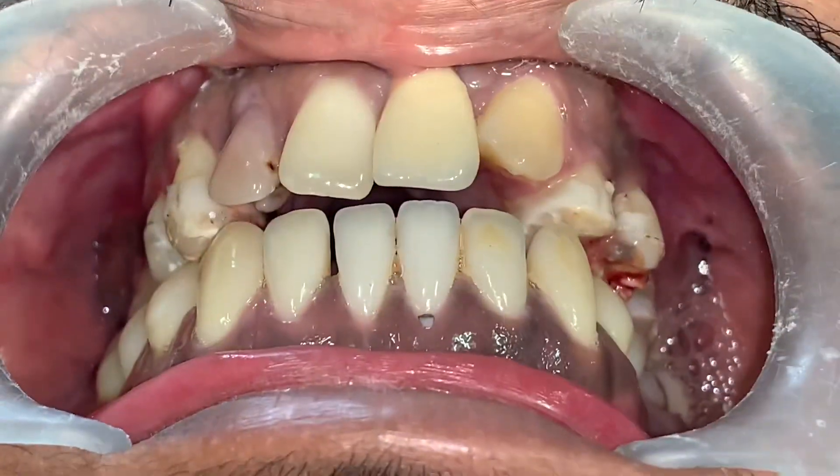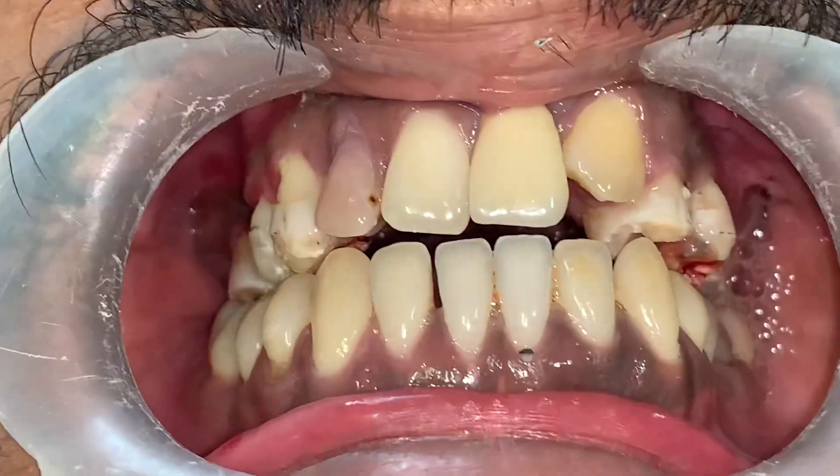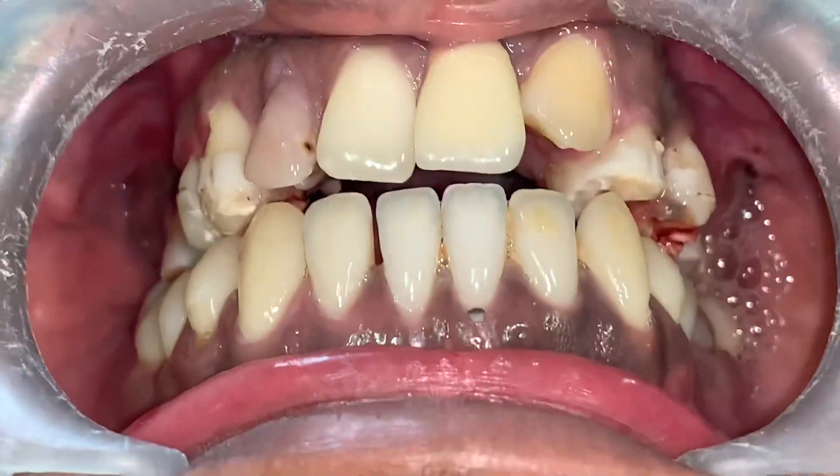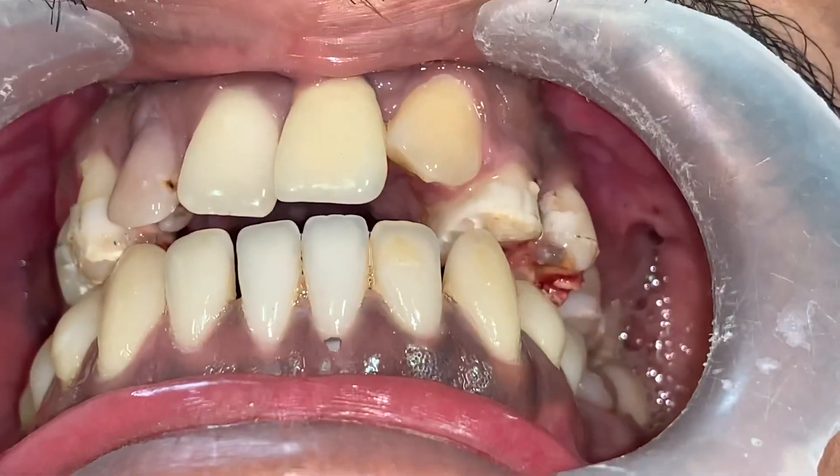You see the occlusion of the cheek — the aperture has moved forward because of the new bone growth, the new bone creation. And now the orthodontist will finish this and align the teeth to perfection.